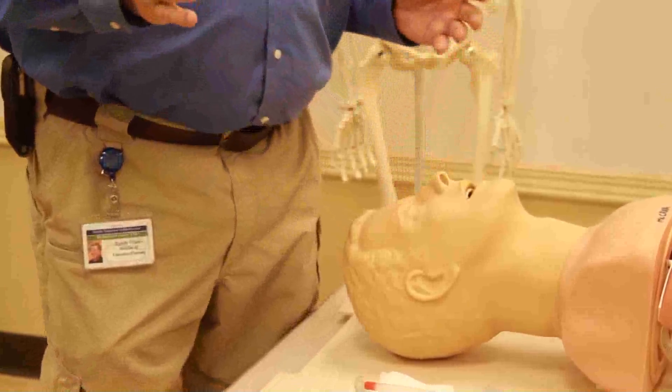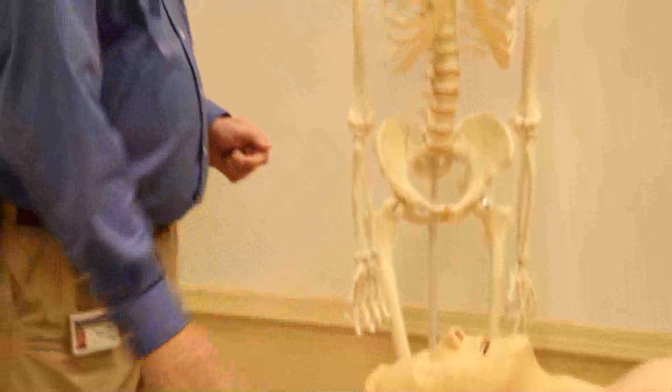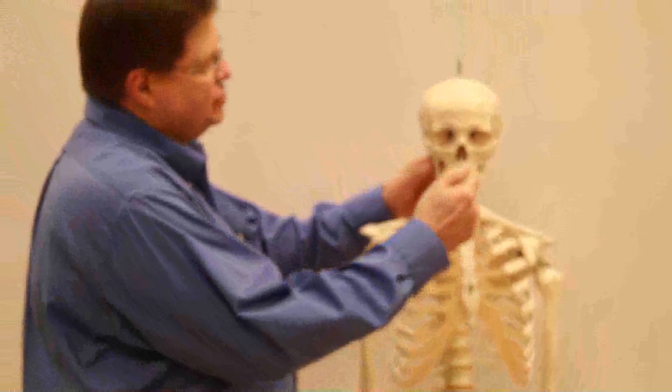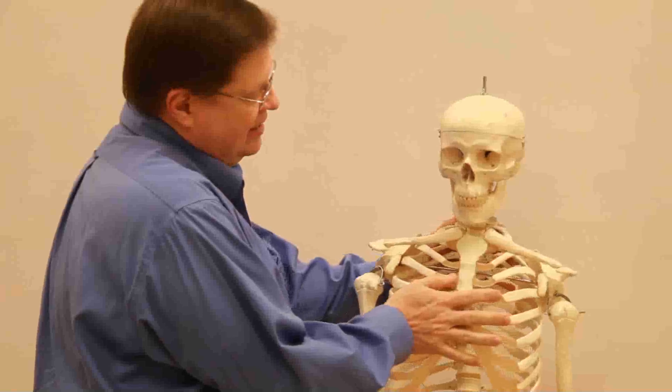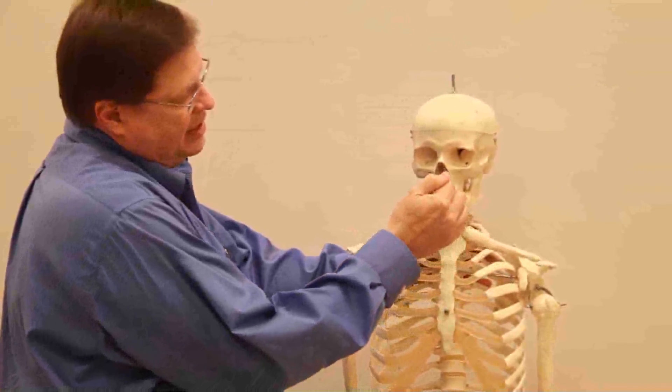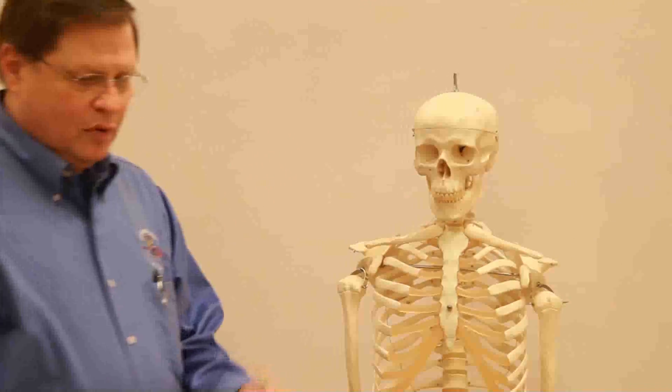The nose actually looks like it comes back toward the forehead, but it doesn't — it actually goes straight down. As you can see here in the mannequin, in our skeleton, it goes straight down, not straight up. So that's why we're going to pull the nose down just a bit.